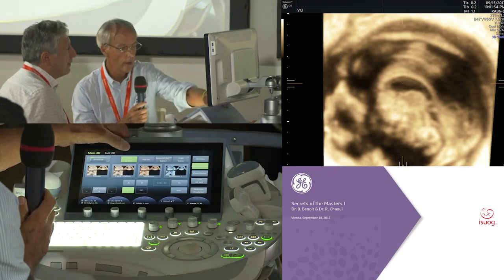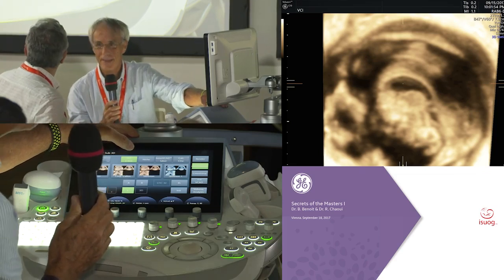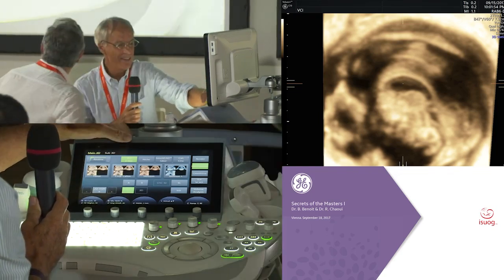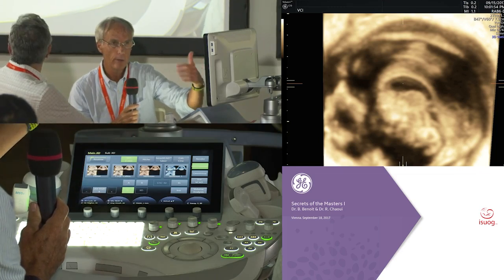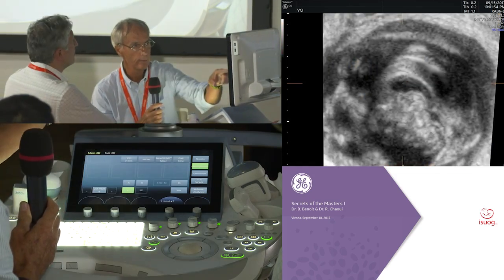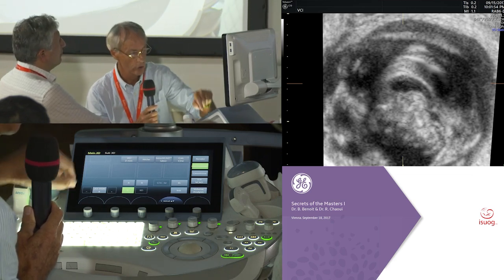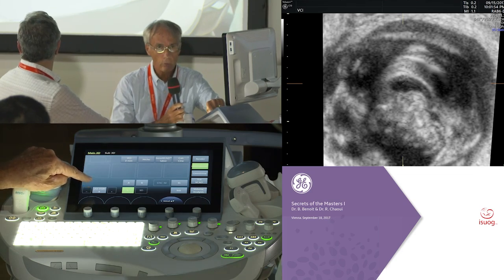Yes, I also used this method a few years ago, but now I prefer to use the new SRI filter, because now there are new SRI filters. So what I will do now, I remove the VCI. This is without VCI. That means we have no thickness of the section. And here you have volume SRI, and this is really important.